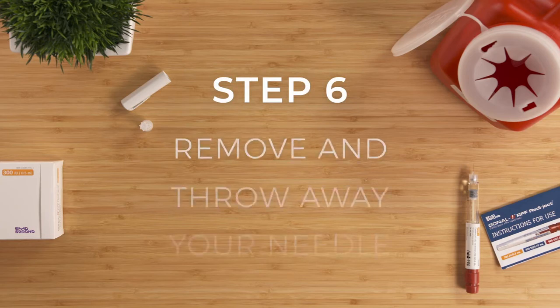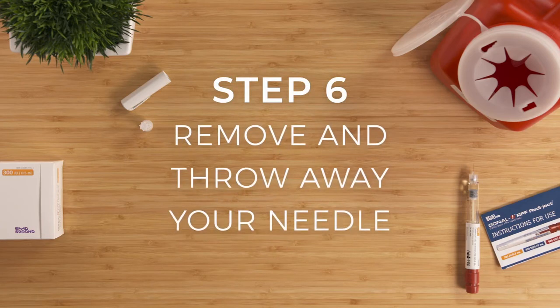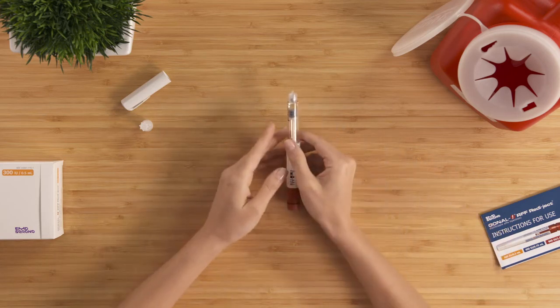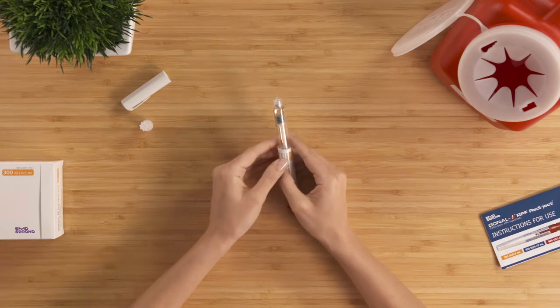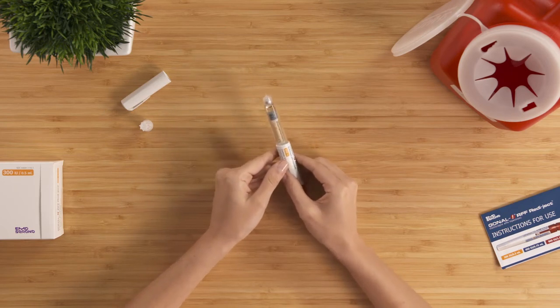On to step six, removing and throwing away the needle. A warning for this step. We must remove the needle from the pen and throw it away after each injection to avoid risk of infection. Always be careful in handling needles.